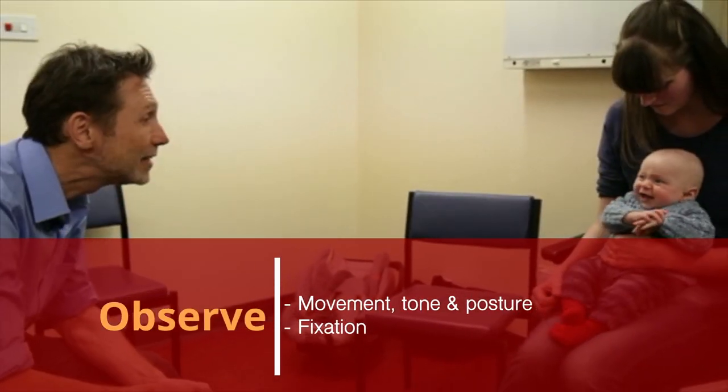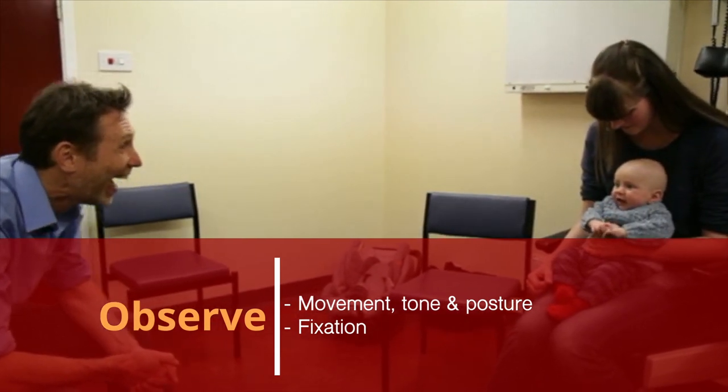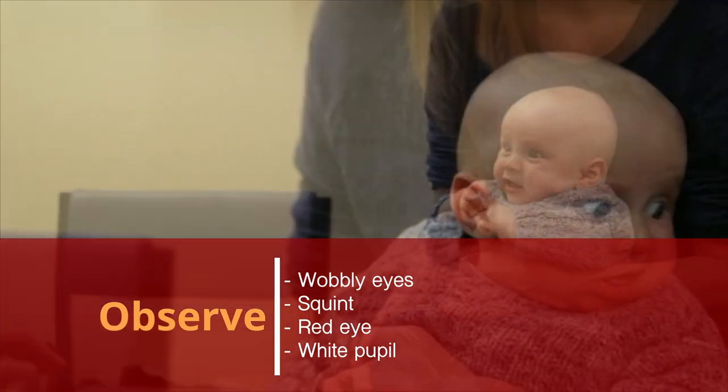Move your head from side to side, increase your distance and make silent smiles. Take note of how steady fixation is, if they respond to your silent smile and the distance at which they lose fixation.